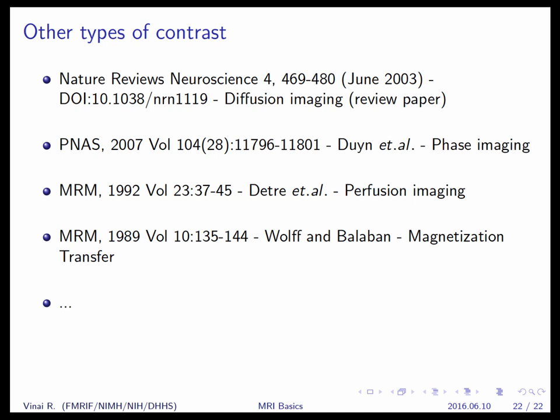You can tease them out if you modulate enough of the parameters. But typically with MRI, you have to choose all the parameters, and then it's a combination of those. It's more complicated than I was thinking it was. The common jargon in MRI is T1 weighted or T2 weighted, and that's simply to maximize the difference in those two exponentials. There's an exponential curve for T2 and an exponential for T1, and it's to get the sweet spot where you can get the most contrast.